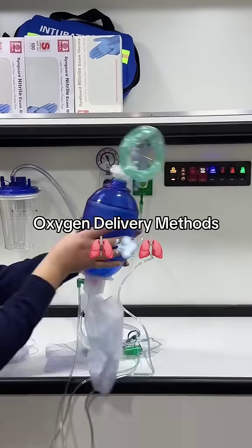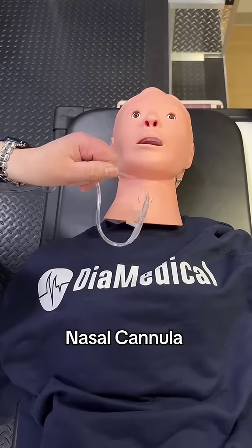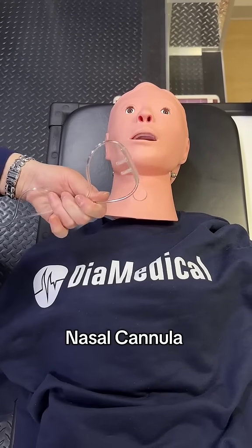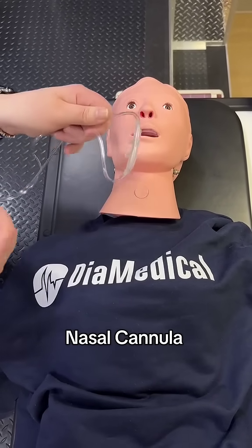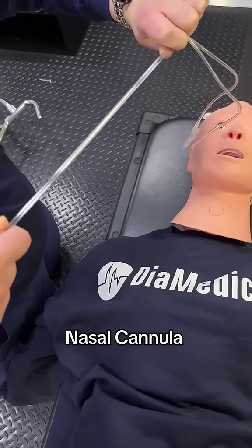It's wheeze season. Let's talk about a couple of oxygen delivery devices. First, the nasal cannula — very common, used for patients with low to moderate oxygen needs, typically somewhere between one and six liters per minute.